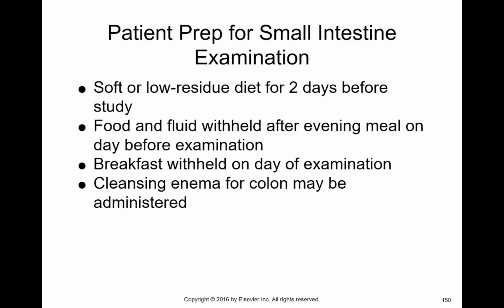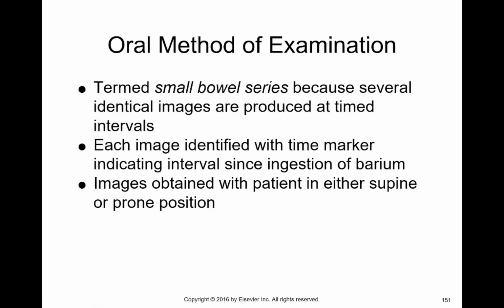So patient prep: the patient needs to have a low residual diet for 2 days before the study, and then food and fluid should be withheld after the evening meal. About the only thing the patient should do after the evening meal is maybe brush their teeth. Some of your hospitals, some of your doctors are pretty particular, and they may have a patient do a cleansing enema on the day of the exam in order to clean them out a little bit more.